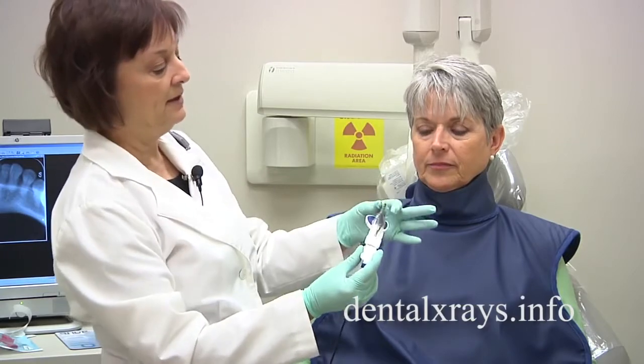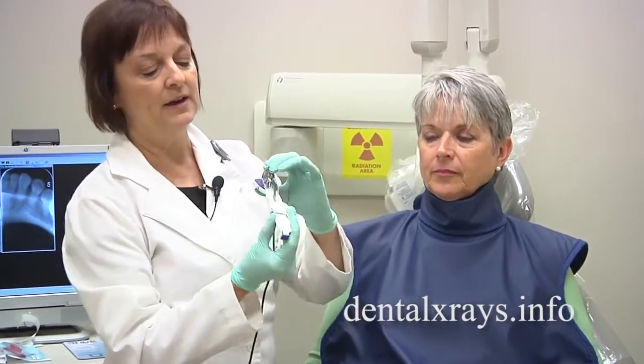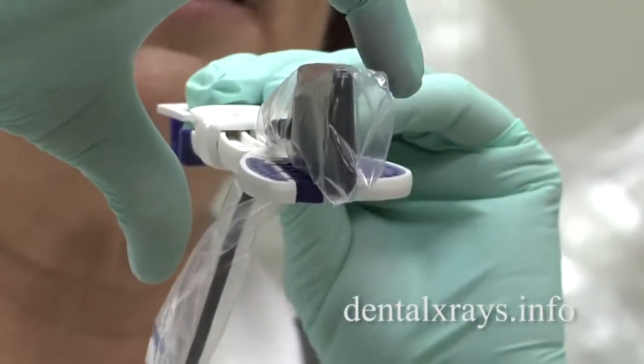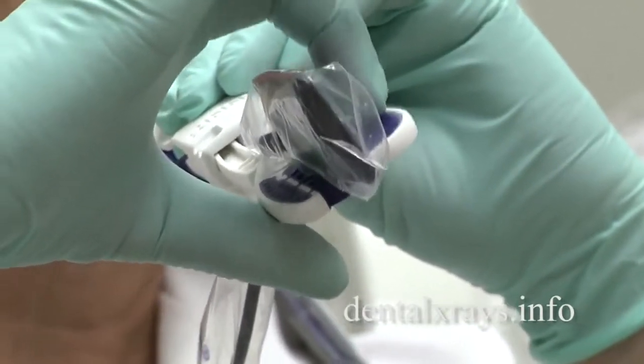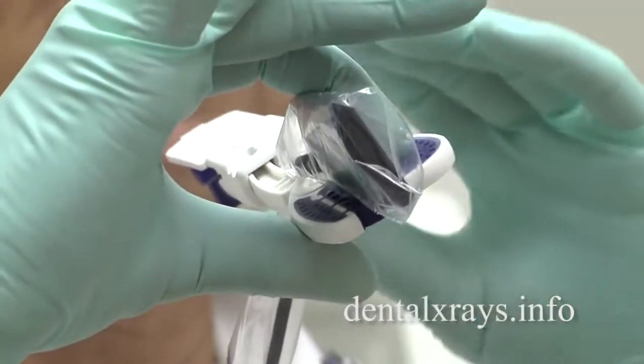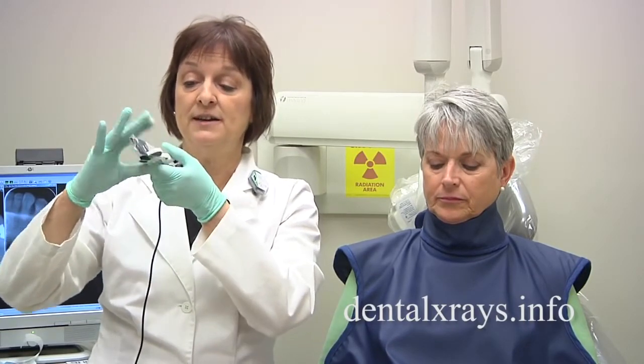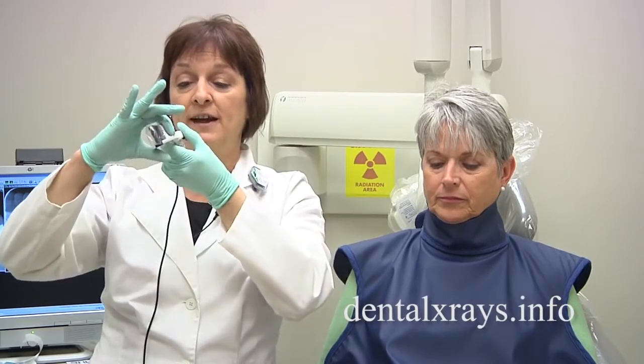First of all, when you place a sensor in the mouth, it is bigger and bulkier. A lot of times when it is in the mouth, the sensor itself is going to hit the roof of the mouth and pull out, which is going to distort your image, and it can even come out of the holder. So what you want to do when you place it in the mouth is tip it slightly so that the patient can reach the bite block more easily and that won't occur. Pulling like this will give you a distorted image by losing the root tips or the bottom edge of the teeth. So with bisecting angle, it's better to turn everything and increase your tube angle than to have them bite hard and cause distortion.